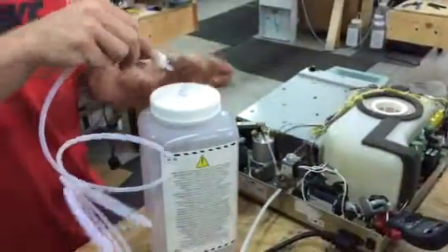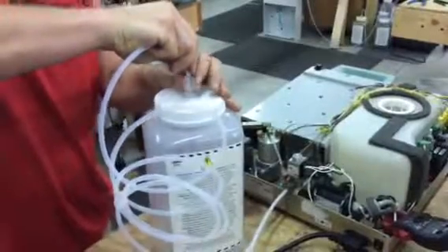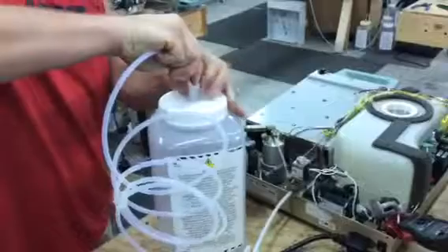Then you take this part, shove it in here as far as you can, push down on this, and then spin the nut. Just like that.